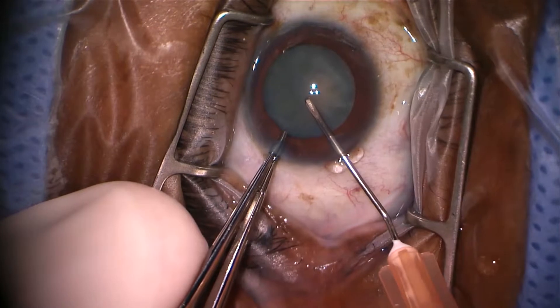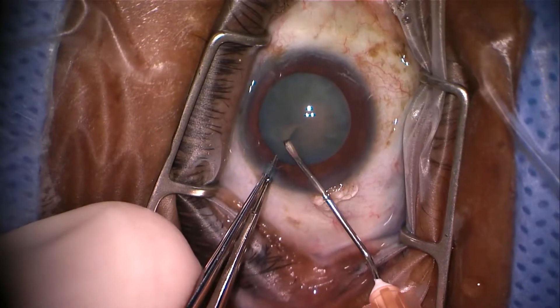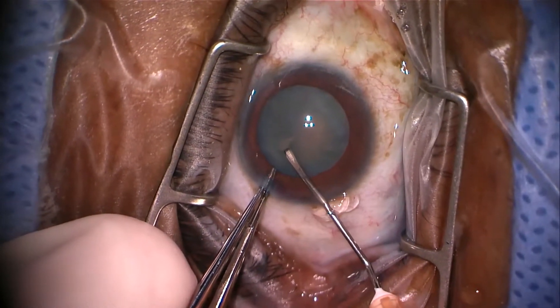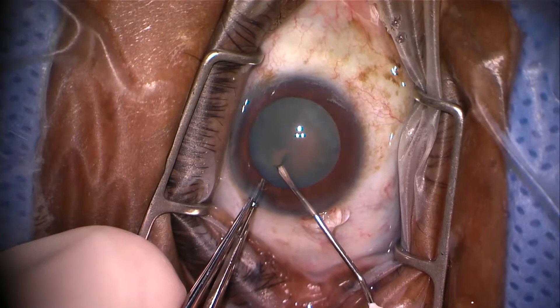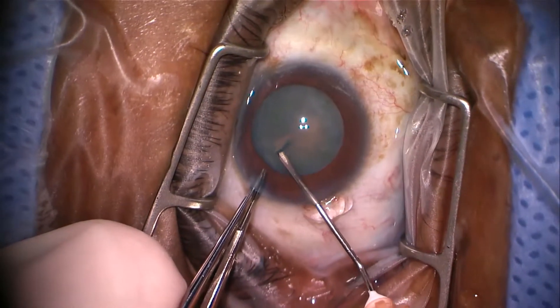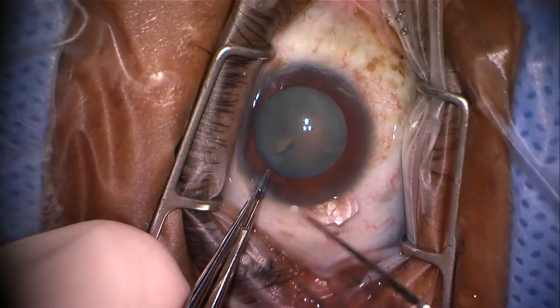Now we've got our cystitome and we're going to gently score and cut the surface of the capsule. You can see milk comes out, and that helps to confirm the notion that there's not a lot of tension in there. Also, we're seeing that the capsule is not extending in a flag phenomenon — either the pressure was perfectly counterbalanced by the viscoelastic, or it just wasn't under tension.